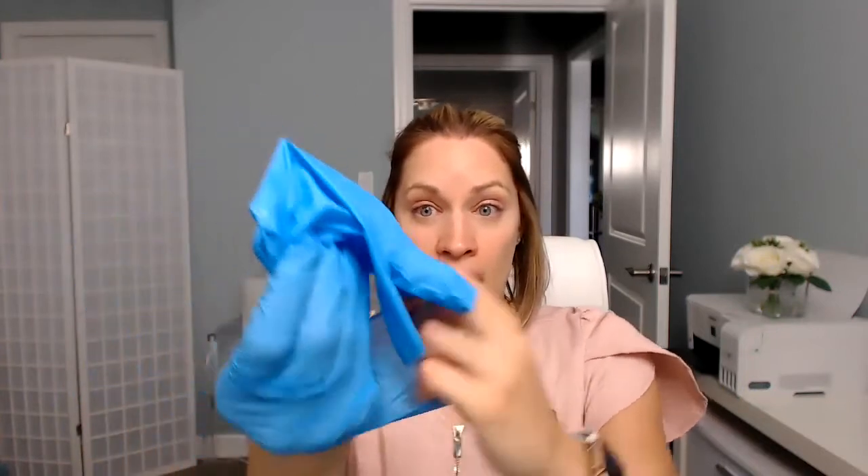I'm going to show you how I take off my gloves when using silver diamine fluoride. I literally take off my glove and put it in the garbage that way, so nothing's going to stain. The stuff is crazy - it stains everywhere. Do you see how it has to be very concentrated on the tooth? I'll leave the link to the Oral Science video so you can see how it's applied.